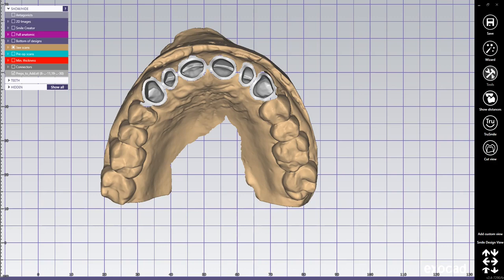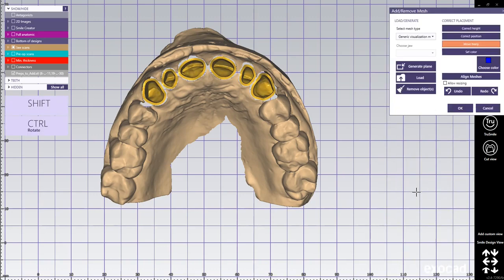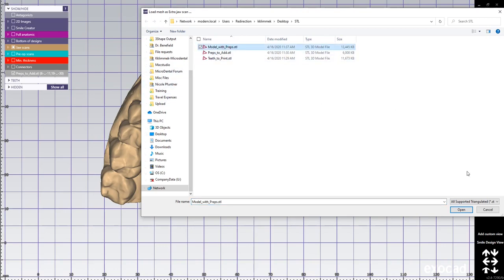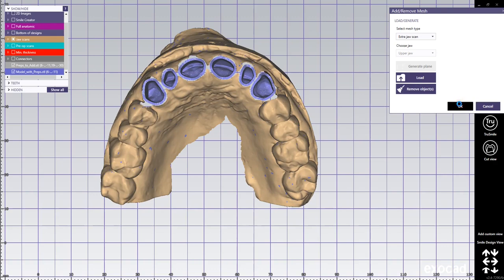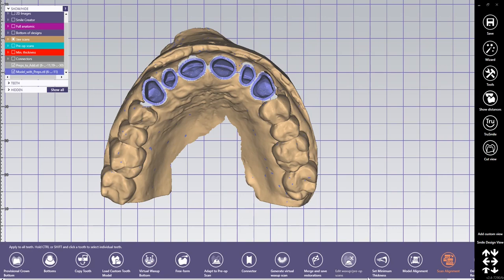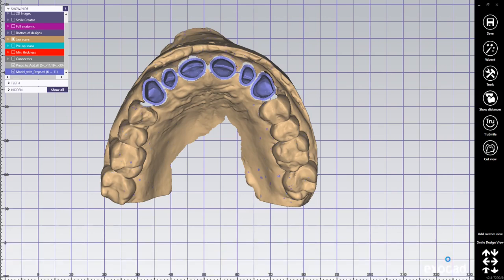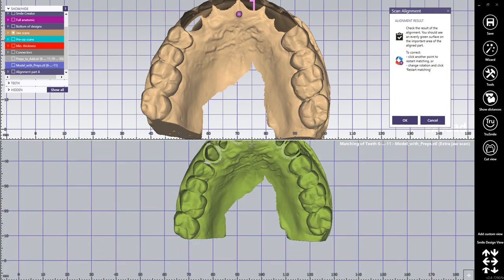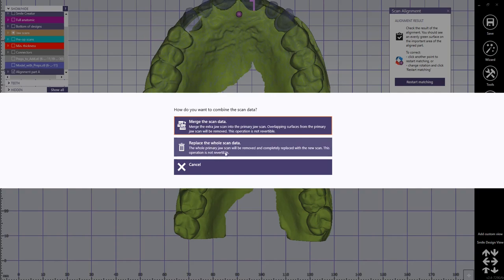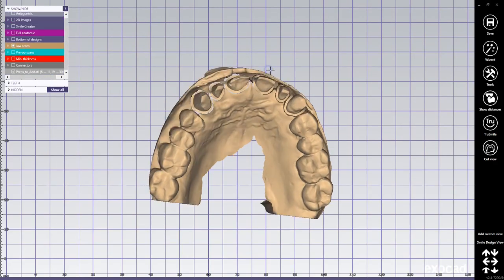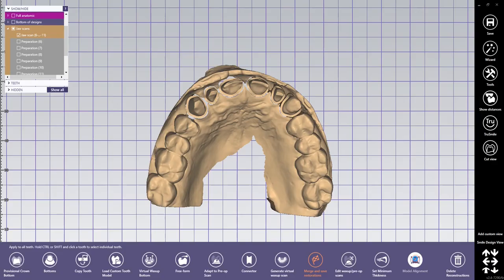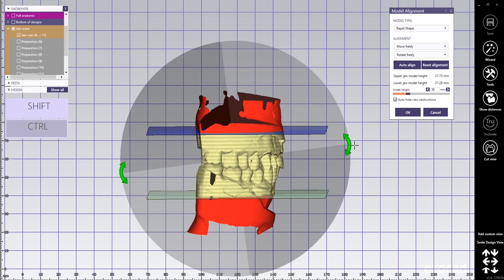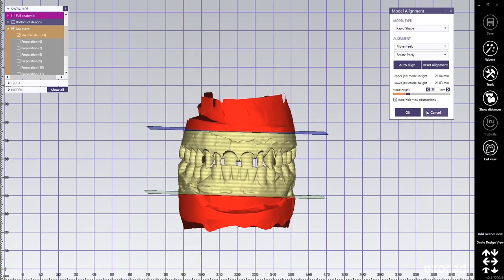I'm going to save it as an STL as a model. Again go to tools, add/remove mesh, go to extra jaw scan, and I'm going to load the model that I just exported with the preps — so everything is in there. Click OK. Now go down in export mode to scan alignment — there it is. Click on it, and you want to align the new prep model with the cut-out model. Click on the papilla — the files are similar — and replace the whole scan data. You want to replace the one that you imported with the one that you cut out the teeth from. Now you've got a full model. I go to model alignment and use rapid shape, bring it nice in the middle. Click OK.